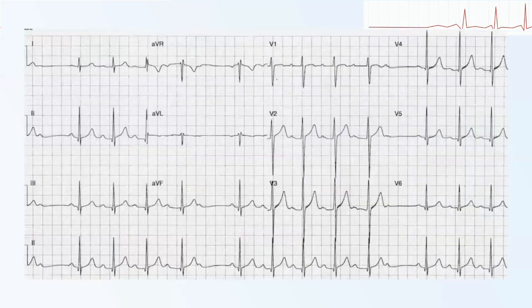So this is just a 12-lead ECG of a Mobitz type 1. In the first part of the rhythm, you can see there's a normal PR, and then it gets progressively prolonged here, and then over here you've got a P but no QRS, and then it starts again like that. This shows a pattern of the AV node cells getting fatigued over time, so they take longer to give the impulse to the QRS, and then they finally give up and just drop the beat there.